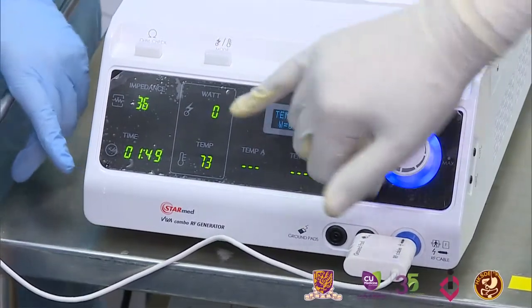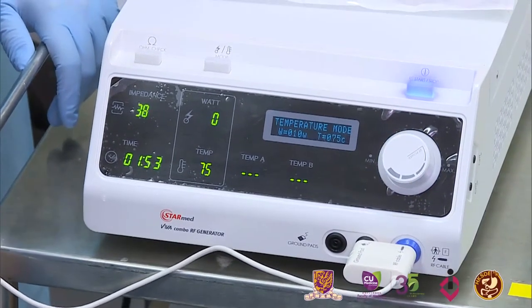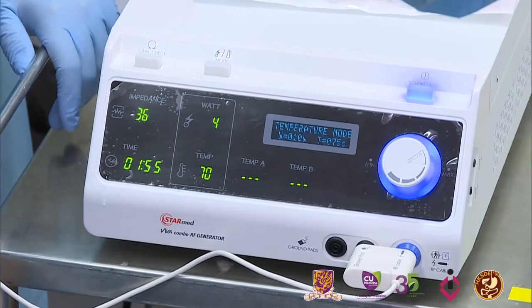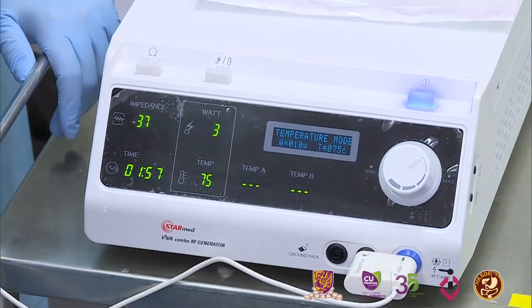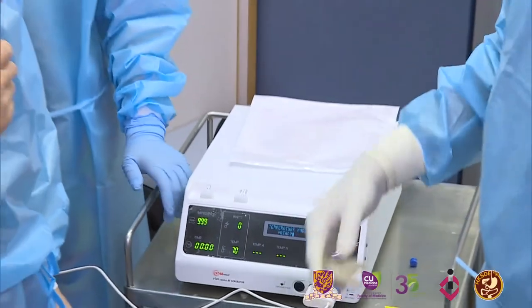Keep watching the wattage, how it's varying, going from 1 to 12. That's the reason why, with the previous machines where the wattage is fixed, we were not doing the right job. We were causing too much charring. Whereas with this machine, temperature is the most important. It's got a cooling system.